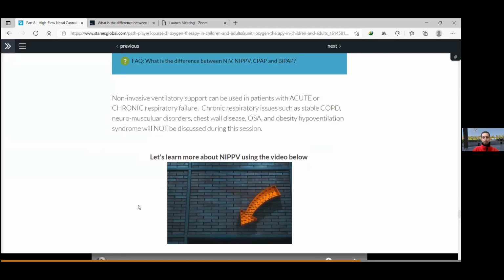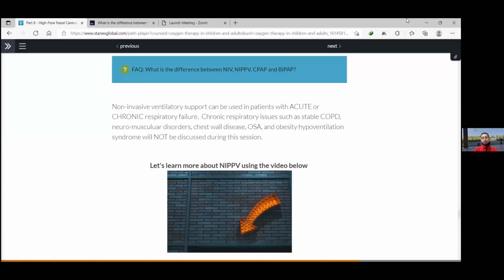One of our participants interestingly raised the issue that non-invasive ventilation could also include negative pressure ventilation, because it doesn't say non-invasive positive pressure ventilation. It is something to be considered, but what we literally use is the same as positive pressure ventilation. It's just an issue of naming. CPAP could be a bit different from the rest, but the rest are all used interchangeably. But negative pressure ventilation has to be considered, as our participants said, and we can accept that as well.